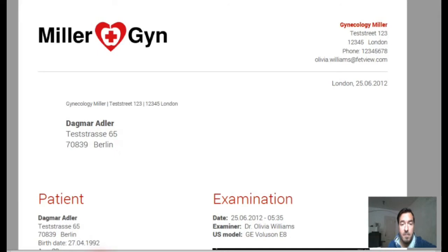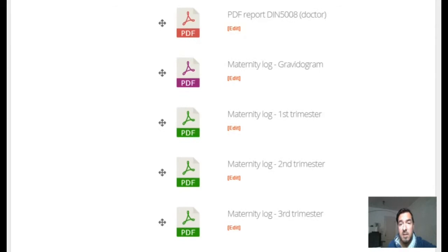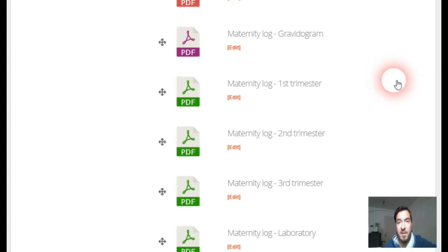If we go to other reports, there's a German-specific feature: the maternity log. It's a German thing, but it's very interesting and very helpful for all of you.